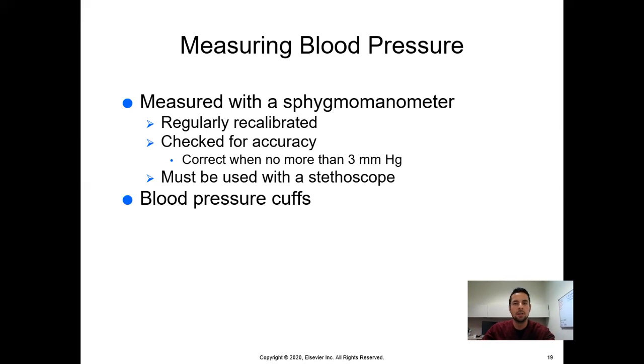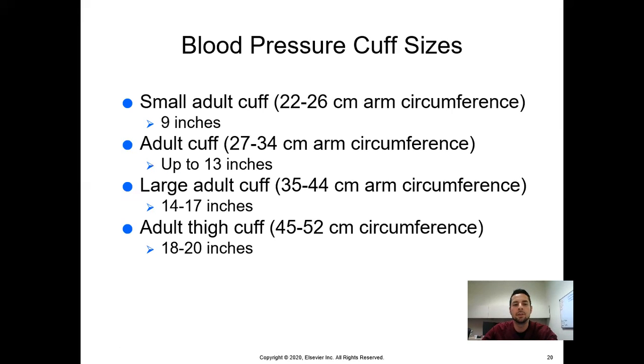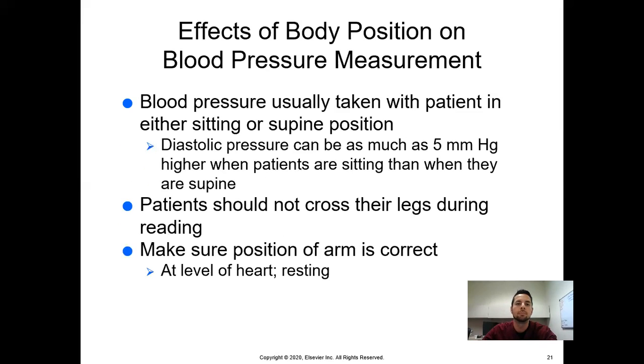Don't make the patient feel insecure about anything. Just have it easily accessible and just switch them out. And sometimes you might even know which patient's coming in, so already have the cuff on there beforehand. All right, there are different cuff sizes out there. Don't just have one cuff size for everyone. Patients come in all shapes and sizes, so have multiple.